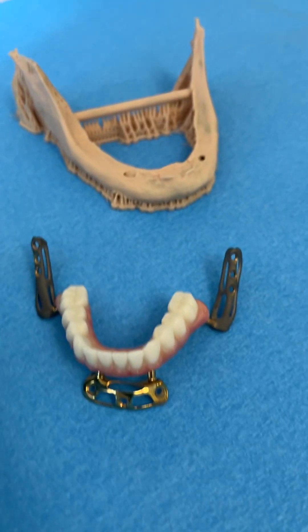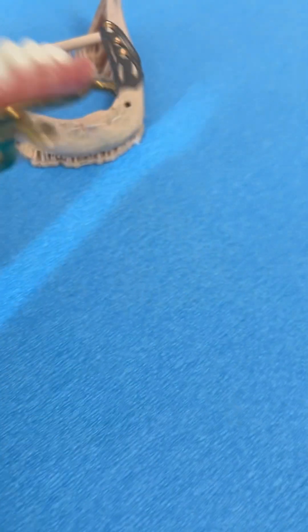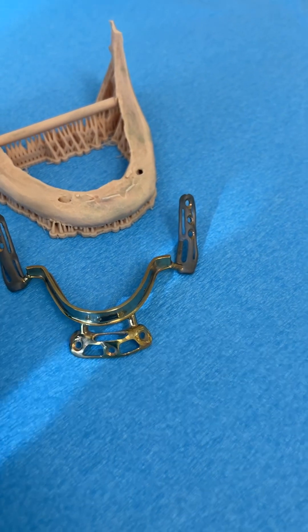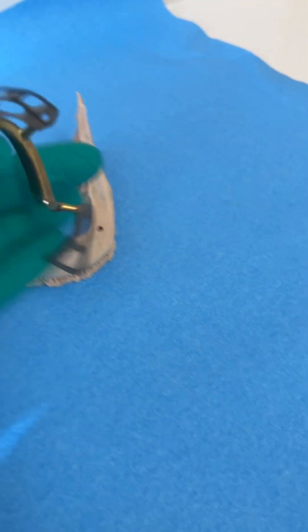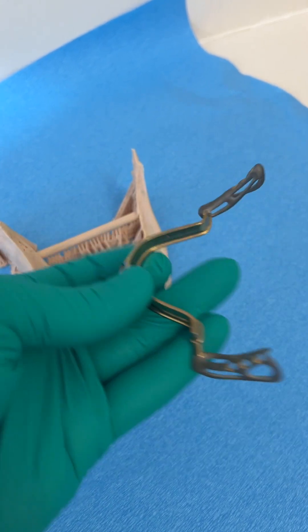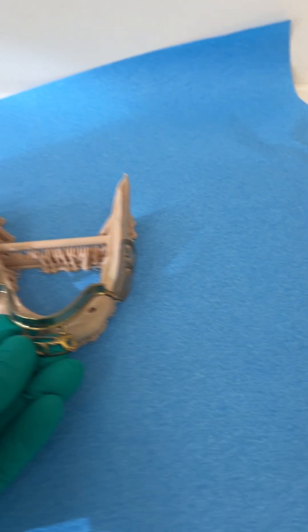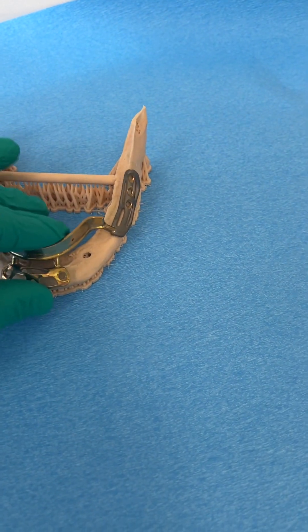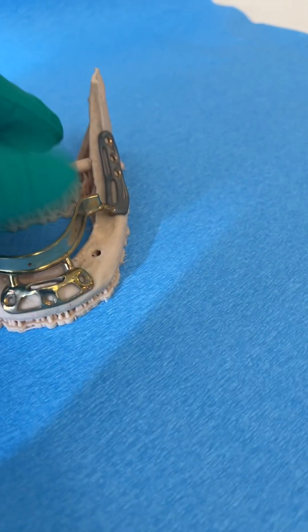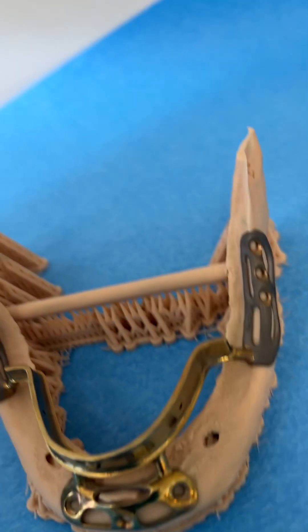This is custom made out of titanium through a very special process. This is the actual subperiosteal implant — custom made milled titanium. The gums are opened and this is placed inside the mouth, through the gums, and it sits on three areas right here.